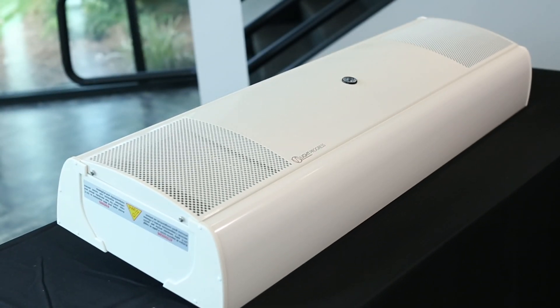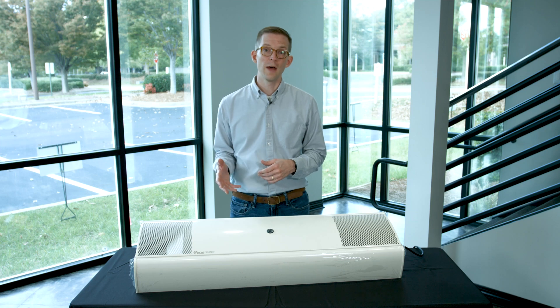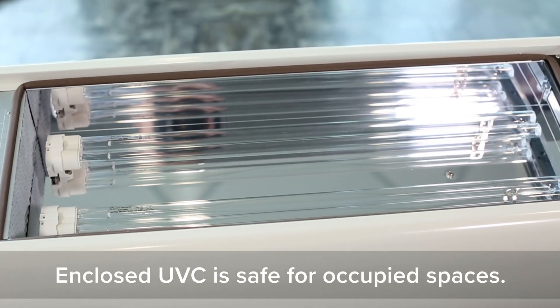This is the UV fan unit by Light Progress. Let's go ahead and open this UV fan unit and I'll show you how to install the lights and get this ready for operation.